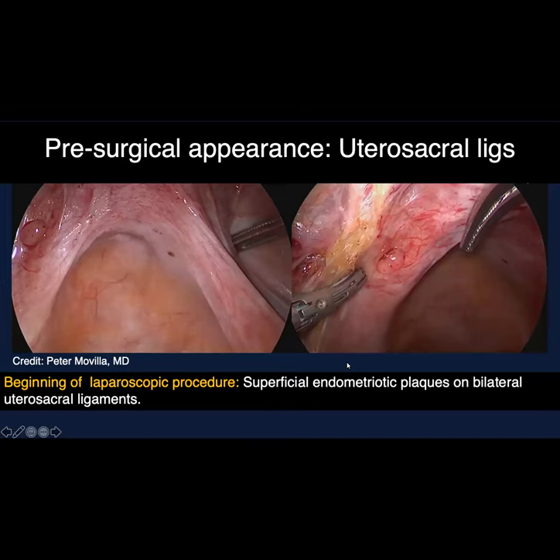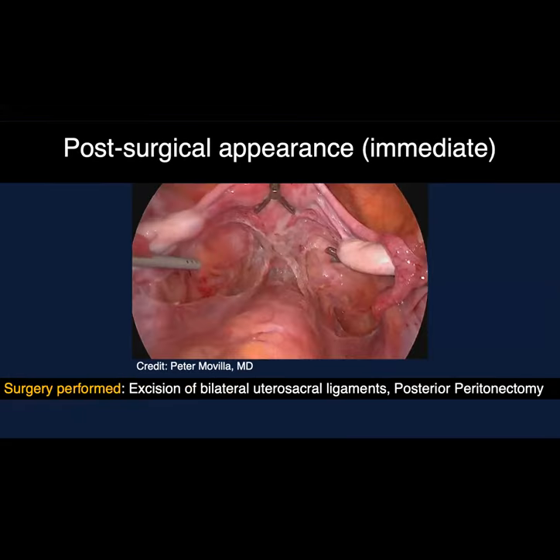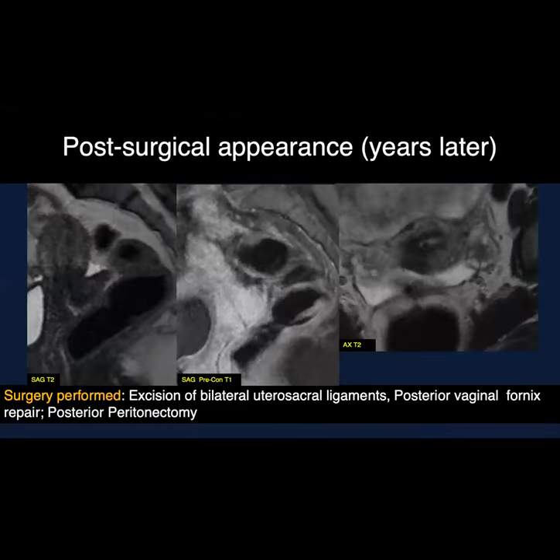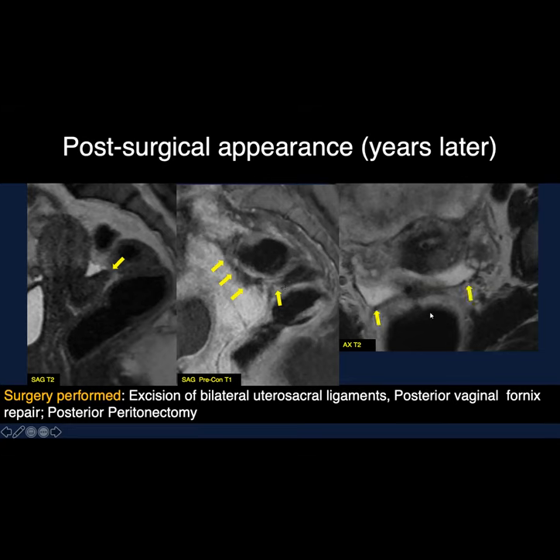This is another patient with less extensive disease involvement — merely superficial endometriotic plaques on the bilateral utero-sacral ligaments. The immediate post-surgical laparoscopic image shows what it looks like following excision of the bilateral utero-sacral ligaments and posterior peritoneum. On MRI a few years later, there is distortion of the posterior vaginal fornix, telltale signs of surgery along the posterior surface of the uterus and cervix, thin filmy fibrosis bridging the cervix to the anterior rectal wall, and a small peritoneal inclusion cyst.